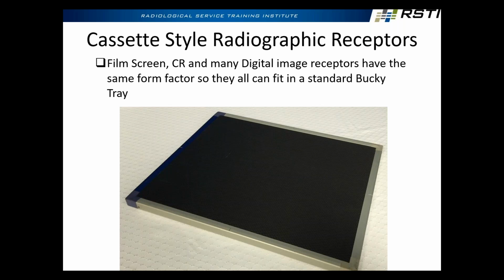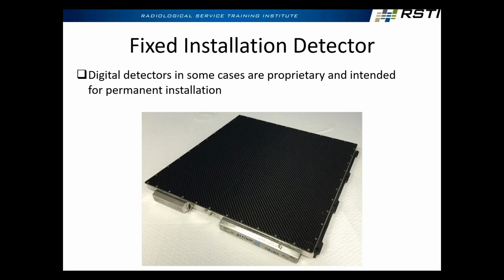But that doesn't mean CR has gone away everywhere. So things like native health services, private practice, vets, chiros, places like that, that don't rely on those reimbursements, they don't care. They're going to keep using them as long as they can because it's cheap, right? We've got a CR cassette there. It's about $1,000. Compare that to a DR detector, over $100,000. So that's the other thing. Everything in diagnostic imaging is expensive.